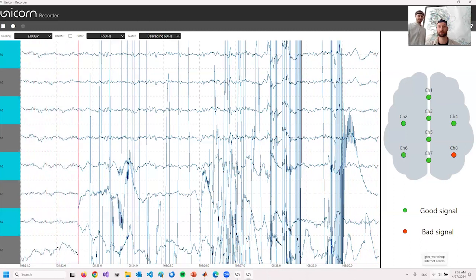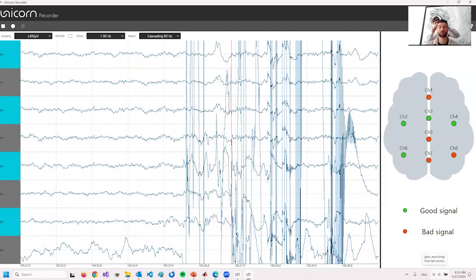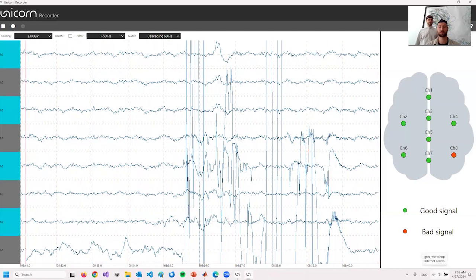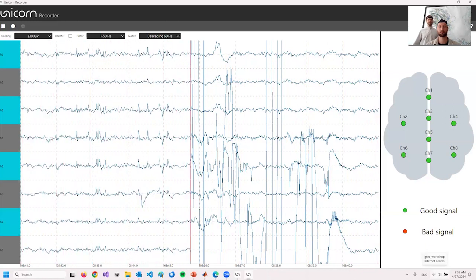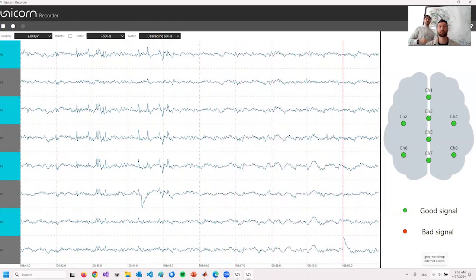All right. Now we should have good EEG on all electrodes. Let's wait until the signal settles. And now I can move around and the EEG is not disturbed anymore. And we have some good EEG to work with.